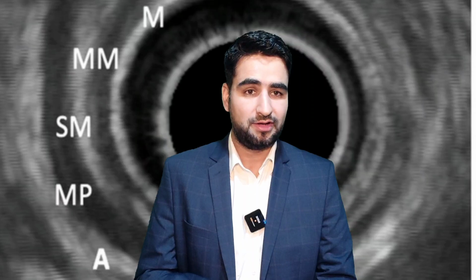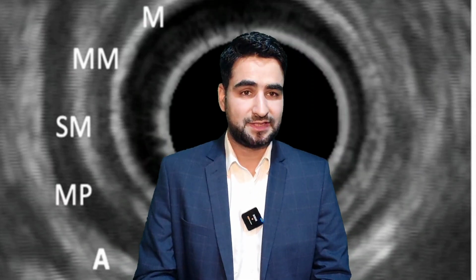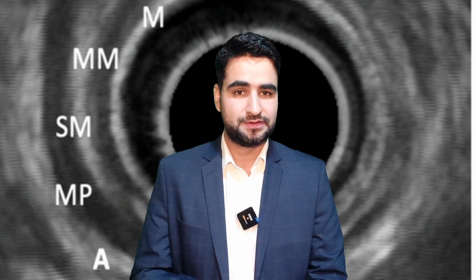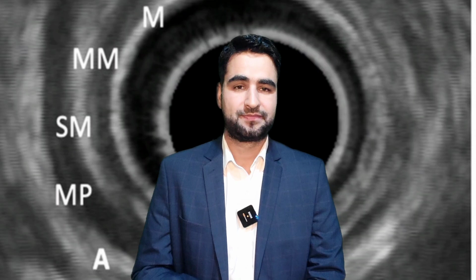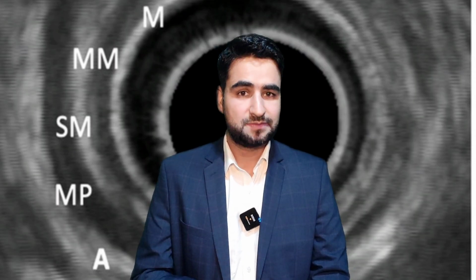Before we interpret this finding, let's quickly review the 5-layer structure of the gastrointestinal wall as seen on endoscopic ultrasound. First hyperechoic layer, that is superficial mucosa. It is actually an interface between mucosa and lumen. Second hypoechoic layer, that's deep mucosa including muscularis mucosa. Third hyperechoic layer, that is submucosa, and fourth hypoechoic layer, that's muscularis propria. Fifth hyperechoic layer, that's serosa or adventitia. The alternating echogenic pattern helps us localize pathology within the specific wall layer.